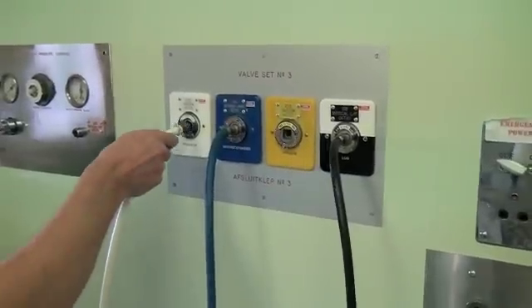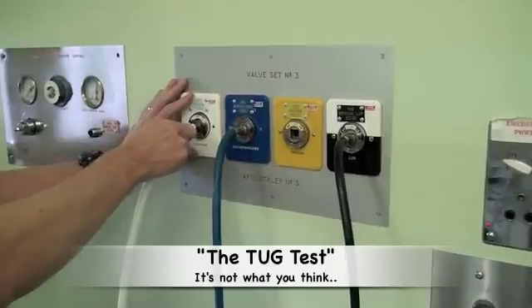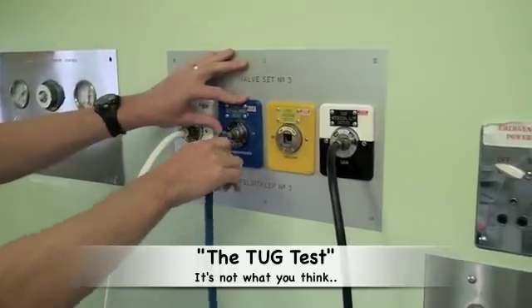Having tested the oxygen failure alarm, one now needs to reconnect the oxygen hosing to the wall and perform the tug test. The tug test is performed for each of the medical gases.